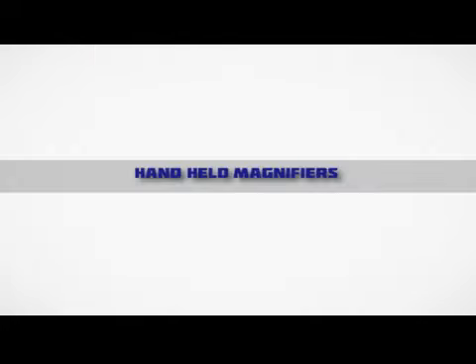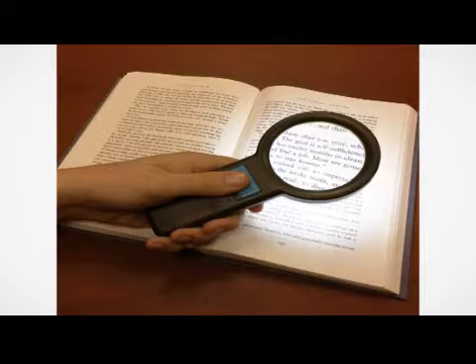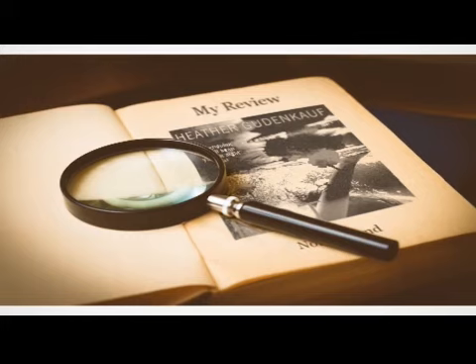Handheld magnifiers. Handheld magnifiers are convex lenses mounted with a handle so that they may be held in the hand rather than mounted on the glasses. The closer the lens is held to the eye, the larger is the field of view. However, the reading speed and duration are usually slower than with the spectacles. The powers are available from 10 to 24 diopters.